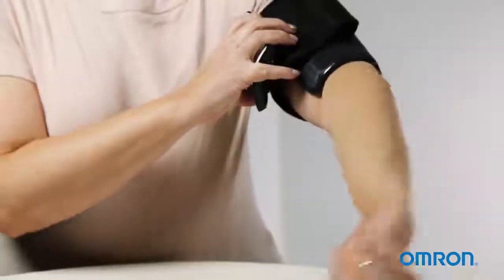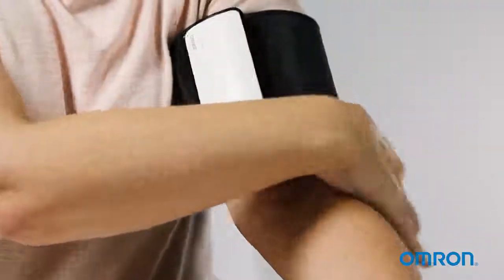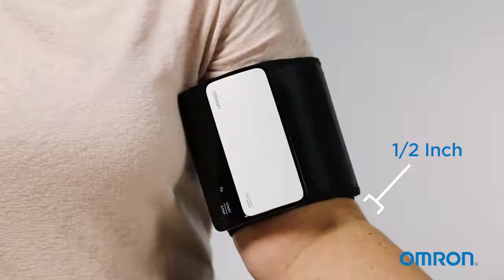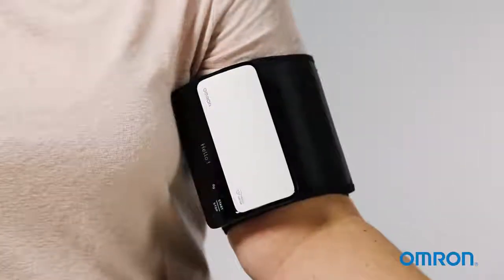Sit comfortably in a chair, keeping your back straight and your feet flat on the floor. Place the cuff on your left upper arm one half inch above your elbow. Securely close the cuff using the fastener. Press the start-stop button to start taking your measurement.